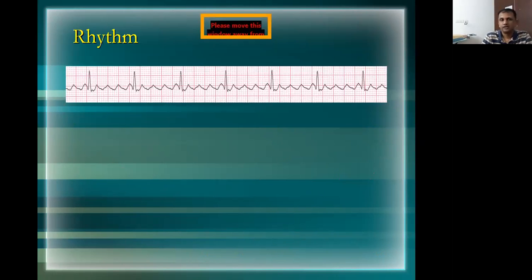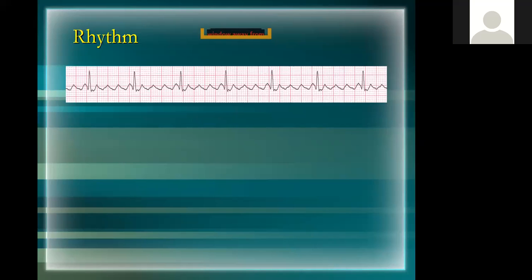Okay, would anyone like to comment on this ECG? So far we've been discussing a lot of things. There's something strikingly catching your eyes on this ECG. Anyone? Come on, guys. I just want to make it interactive. Feel free. I don't want it to be more like a lecture. It is flutter, sir. Excellent. Why do you say it's a flutter? Sawtooth appearance of the ECG. Fantastic.